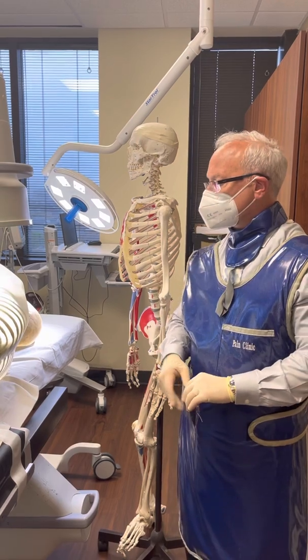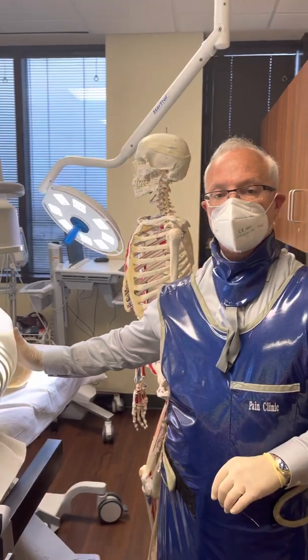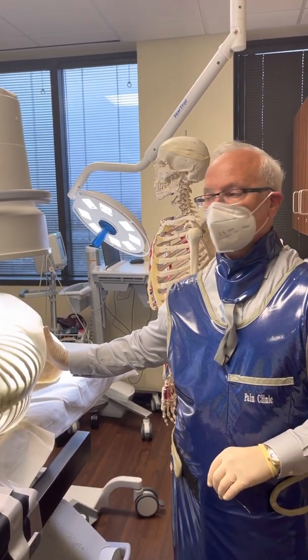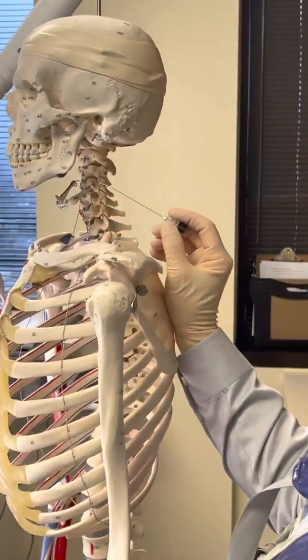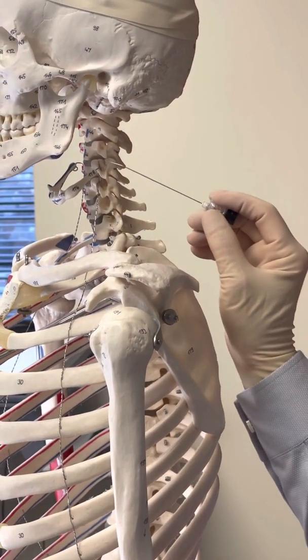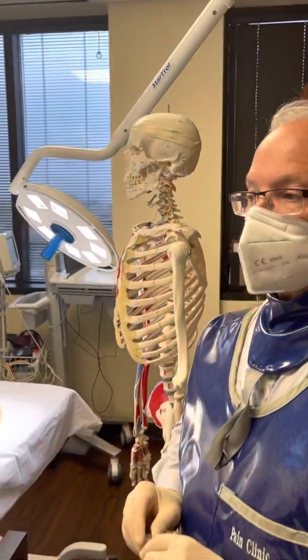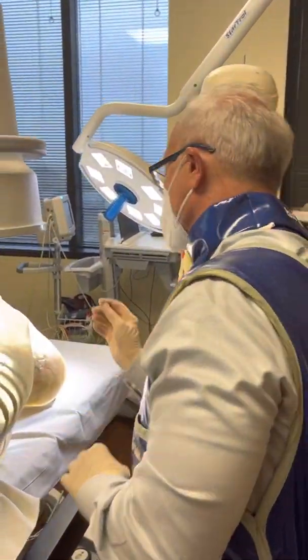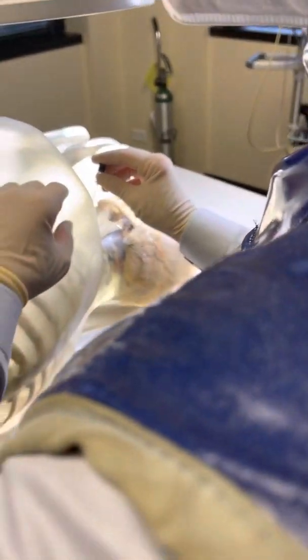After performing a sterile skin prep and drape of the site in question, I anesthetize the area using 1% lidocaine with a 27-gauge, 1.5-inch needle. Remembering that my goal is to be in the cephalad and dorsal part of the neural foramen, and taking great consideration of the vertebral artery, which is housed in the foramen transversarium, assuring that we do not trespass on that structure. Once I've anesthetized the skin and taken my scout film, I will be advancing my needle towards the neural foramen.